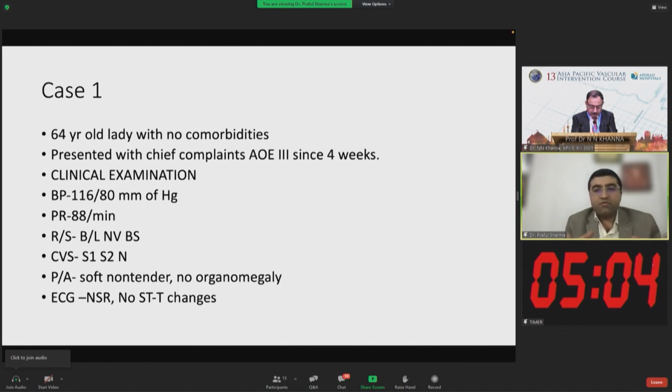Now, there are a large number of treatment modalities available to the interventional cardiologist, starting from various kinds of balloons, the various atherectomy devices, even laser, intravascular lithotripsy, and a number of other techniques. So how can imaging help me to upfront select the correct treatment modality, which will depend on the amount, the character, the distribution, and the severity of the calcification, and how can we use this algorithm to improve short-term and long-term results, to make the procedure safe and, most importantly, stress-free.